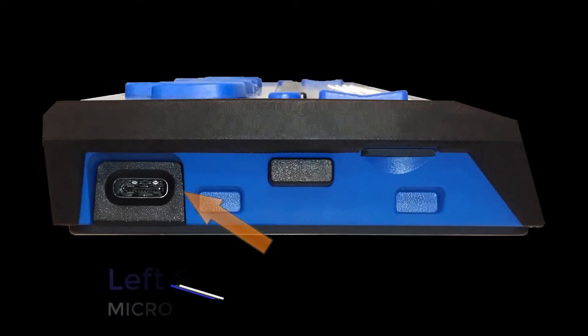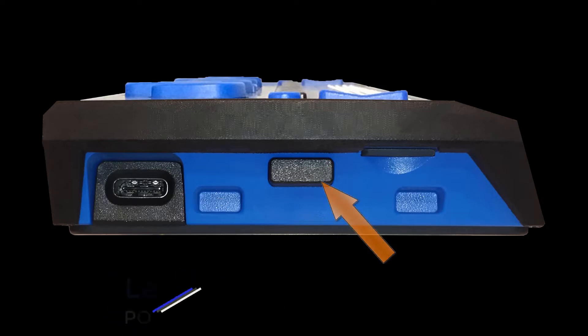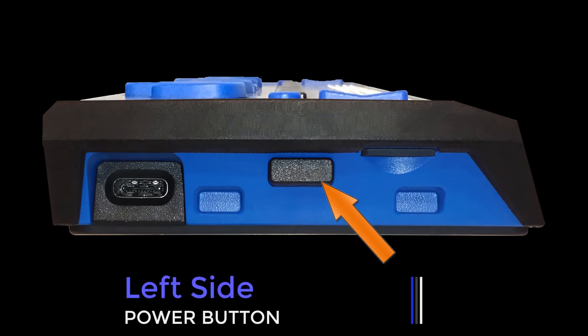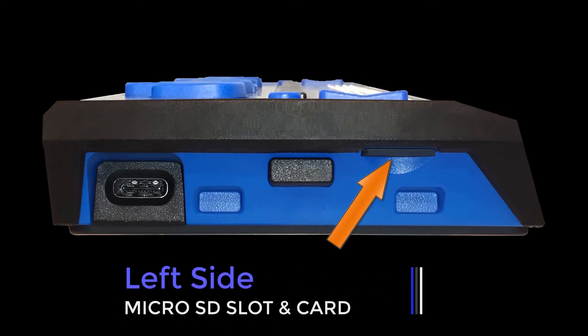Beginning on the left side of the display, the USB port allows you to connect your display to the computer using the supplied USB cable. The power button turns the Focus on or off when not connected to USB. Press and hold it for 2 seconds to turn the display on, and 4 seconds to turn the display off. The Focus includes a micro SD card and supports cards up to 32 GB in capacity.